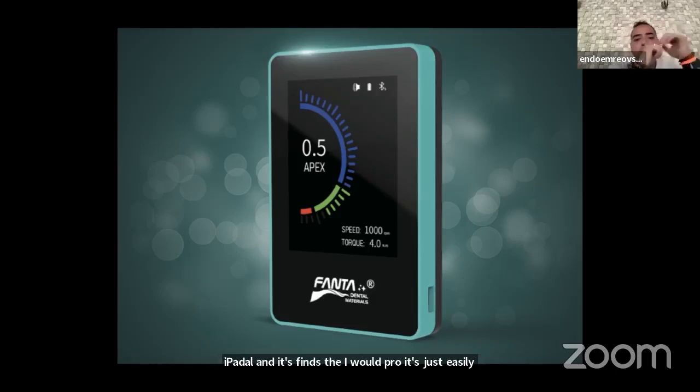And also, I always advise you to clarify and adjust the millimeter parts. You don't have to reach the red line. You just need to be 0.5 millimeter from the apex. You should be 0.5 millimeter above the apex to work out your working length, and then you can easily adjust your file inside the root canal to calculate your working length.